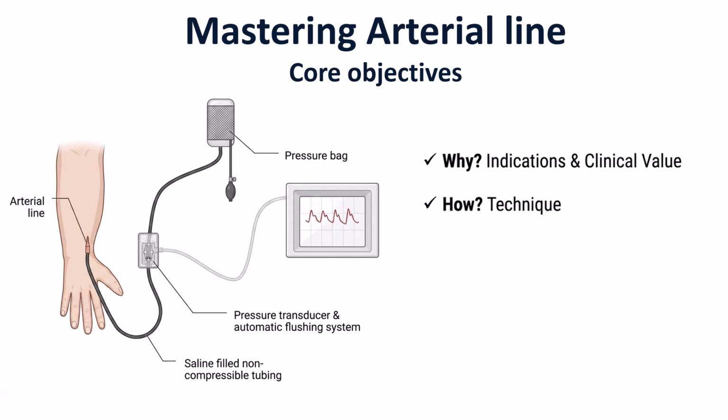Welcome, everyone. Today, we are diving into a comprehensive review of arterial line monitoring. In this first part of the video, we will explore why arterial lines are used, when they are indicated, and how they are placed.